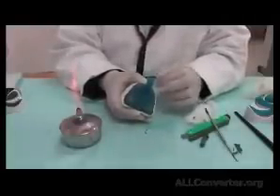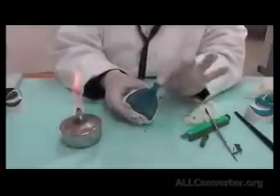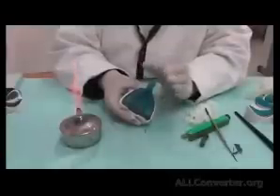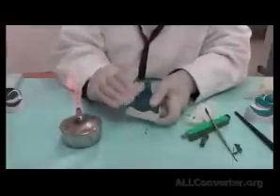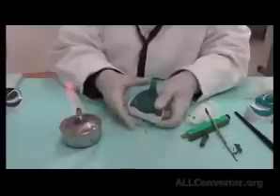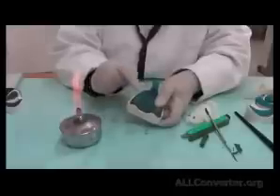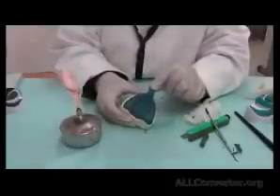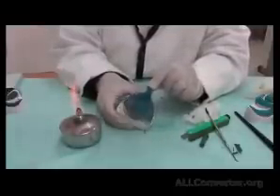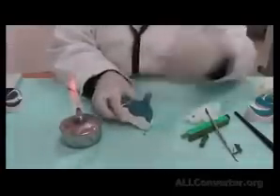And this is one of the features of a correctly border molded tray, that is stuck in place, not by the green stick, but by the suction. Once we squeeze on it, the tray will extrude under pressure. All of the air bubbles in between the two surfaces will be pushed away. And what we will have is a thin film of saliva and the tray and the borders sealed very well. So they act as a suction cup. So the tray is easily adapted to the patient, pressed into place, and then it becomes retentive. That's what we call seal, border seal.